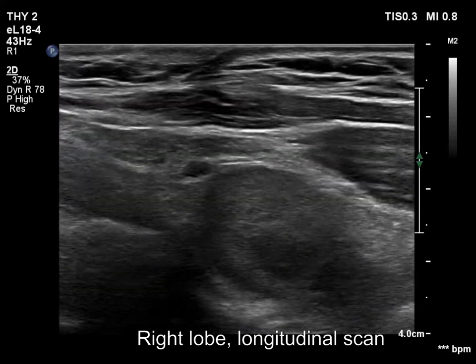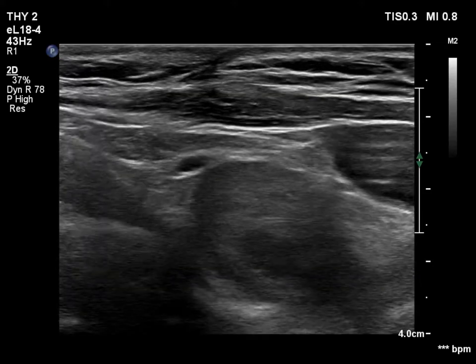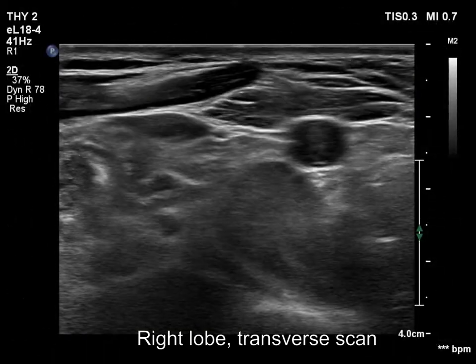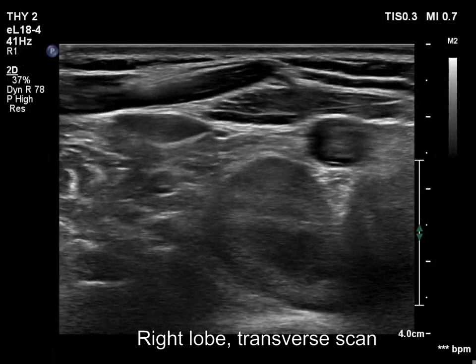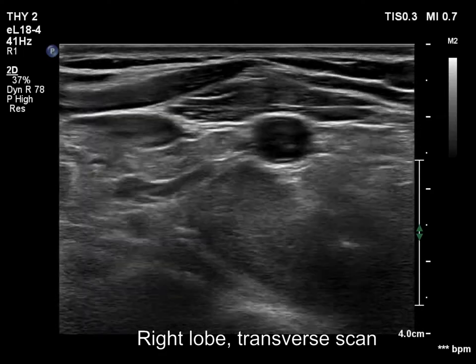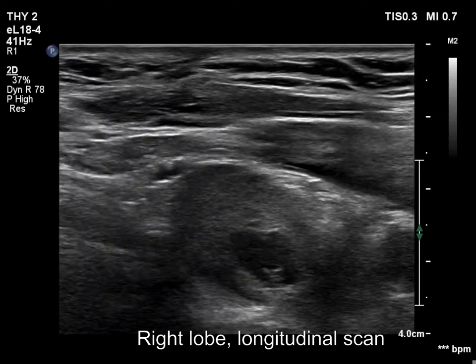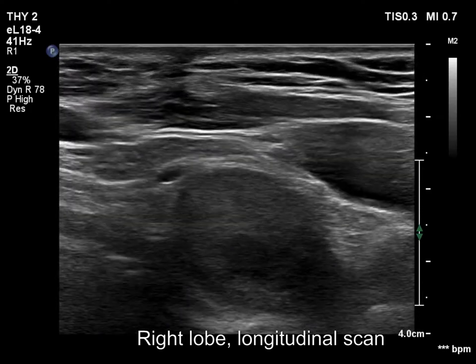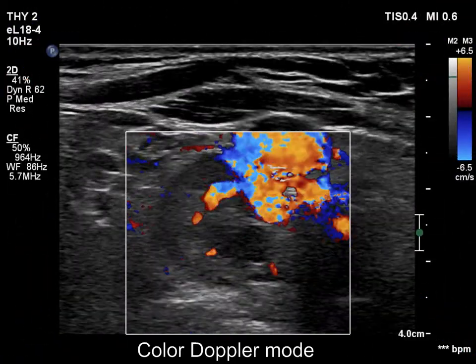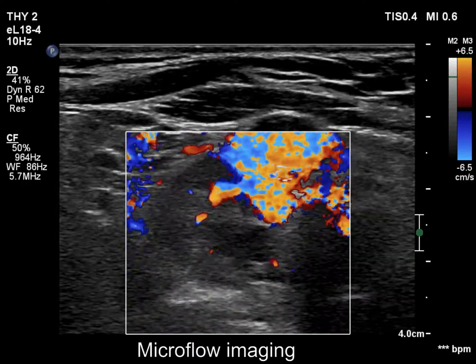The enlarged right lower parathyroid is seen dorsal to the carotid artery. The mass is moderately hypoechoic and has a small cystic area in its central part. The parathyroid adenoma is located just dorsal and lateral to the carotid artery and has a large vessel.